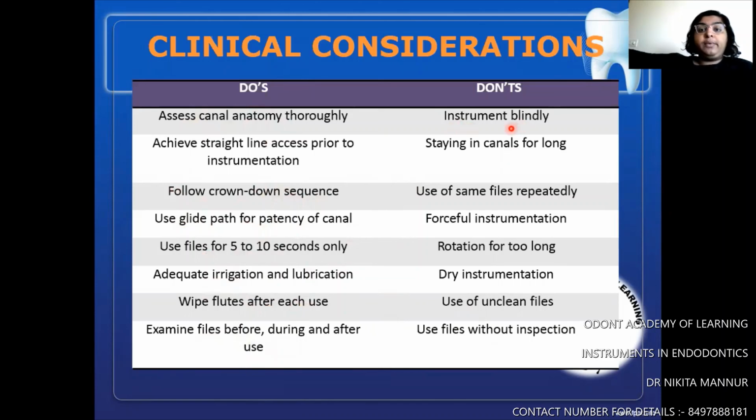Don'ts. Do not instrument blindly. Never ever put the file inside the canal without seeing what you're doing. Do not stay in the canals for long. Never use the same files repeatedly. Files tend to wear and tear. Please do not use the same files repeatedly. Do not force the file inside the canal. Do not rotate for too long. Do not use a dry file.